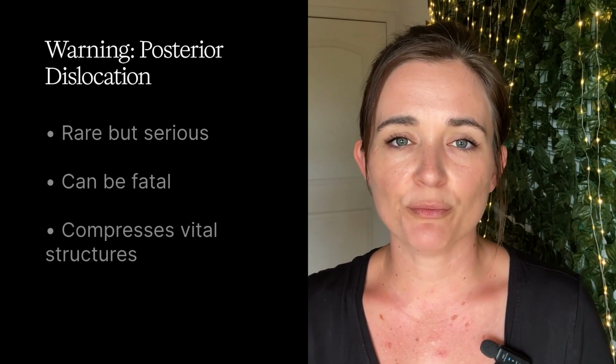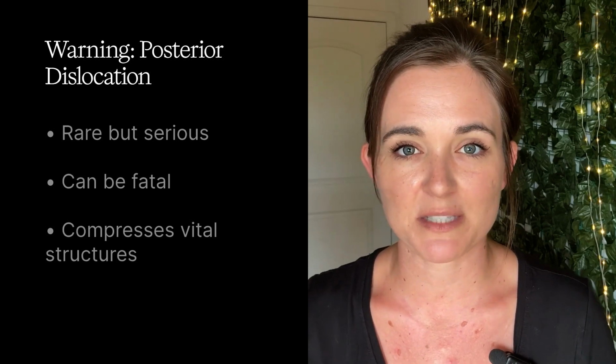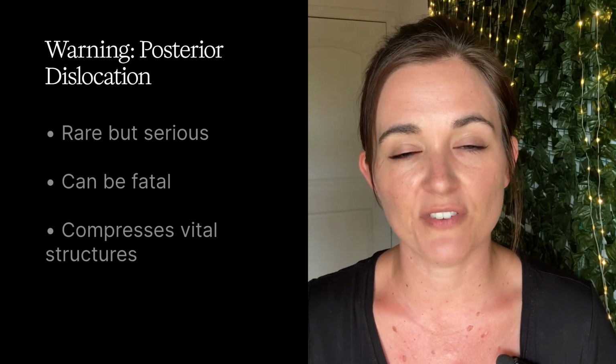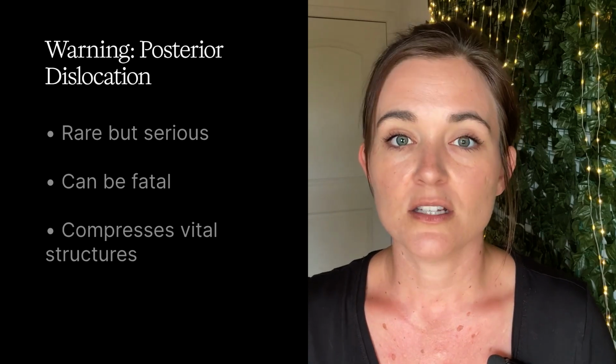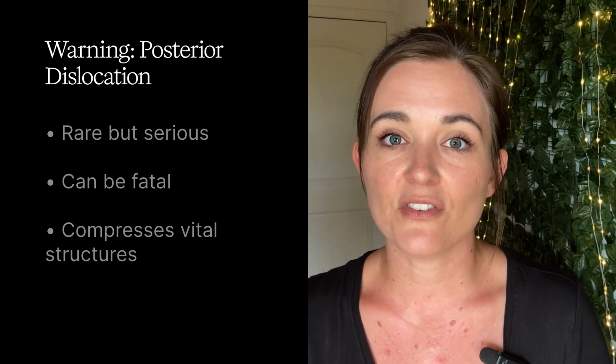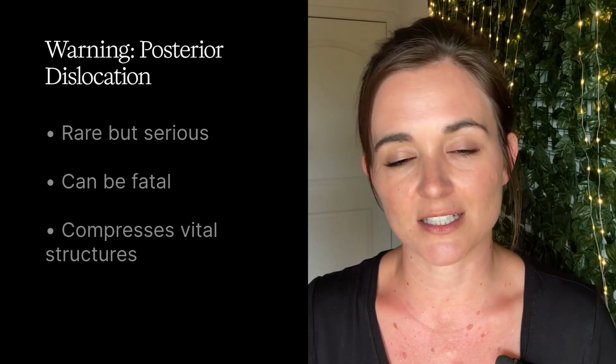And just to drive it home, if you see any signs of posterior displacement, flag it immediately. Posterior dislocations are rare, but can be fatal if they compress the trachea, subclavian vessels, or even the aorta. This is a life-saving view, not just an academic one.